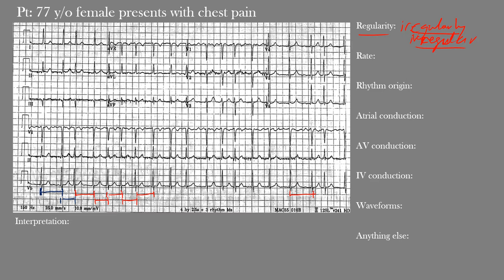The next step is the heart rate. Because we have an irregular rhythm, we estimate the heart rate by counting the QRS complexes across the EKG and multiplying by six, since the entire EKG represents 10 seconds. Counting across: 1, 2, 3, 4, 5, 6, 7, 8, 9, 10, 11, 12, 13, 14, 15, 16, 17, 18, 19 — there are 19 QRS complexes. 19 times 6 is 114 beats per minute — above 100, above our adult normal range — so this is a tachycardic rhythm.